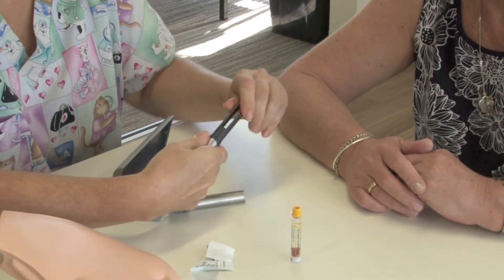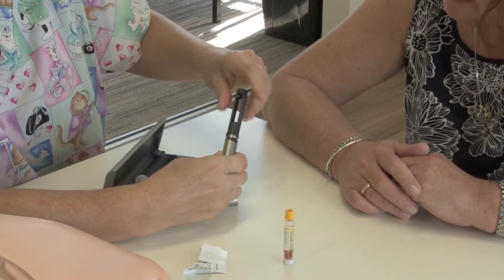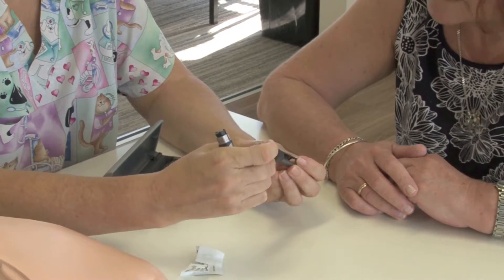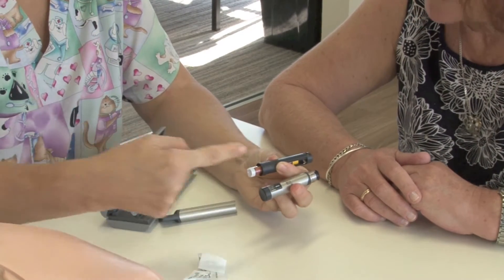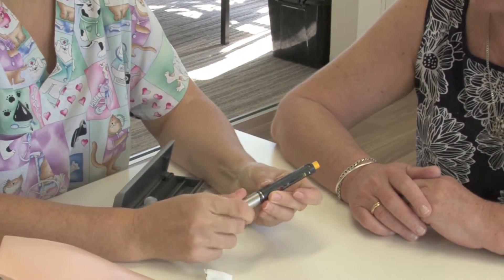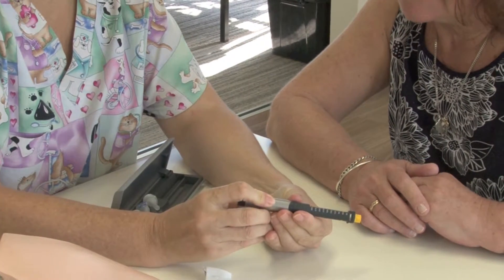So what we need to do is unscrew this piece — the top off the base — like that. Now make sure that this end here goes in that way. Because when you put it into the pen, we're going to dial from this end and that's going to push the plunger forward. So that goes in there, and it's now ready to use.